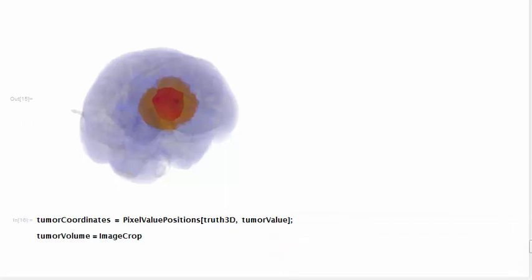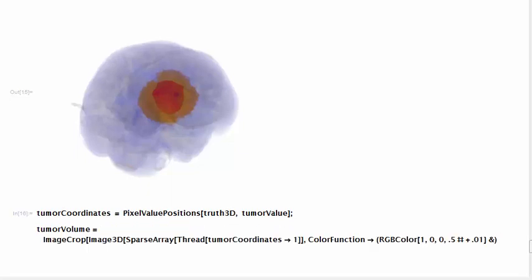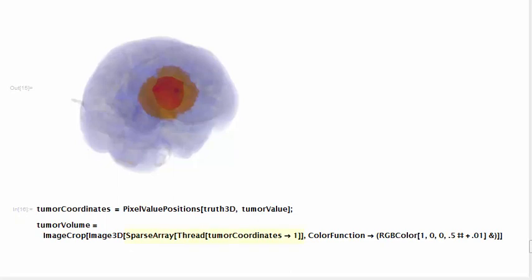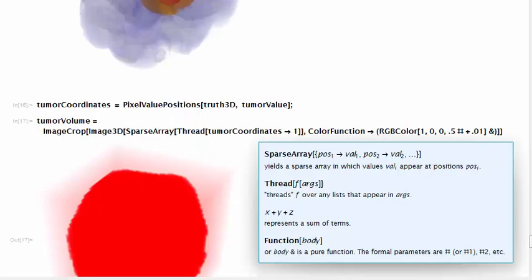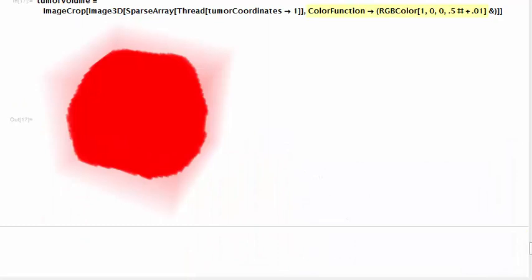However, we can't simply pass these coordinates into Image3D. We need to remap them into a sparse array. Inside this call to sparse array, we call thread and define a rule assigning the value 1 to all tumor coordinates. We then pass a color function as a second parameter to Image3D. I use red with a high value of alpha here, but you can experiment using other colors.